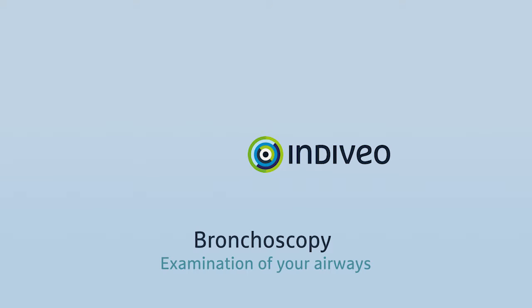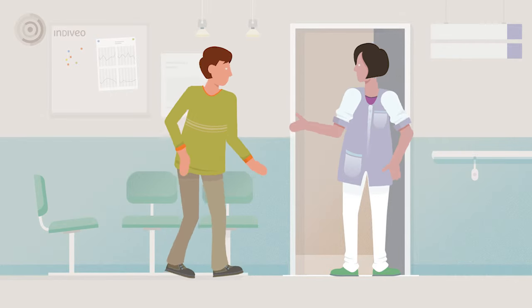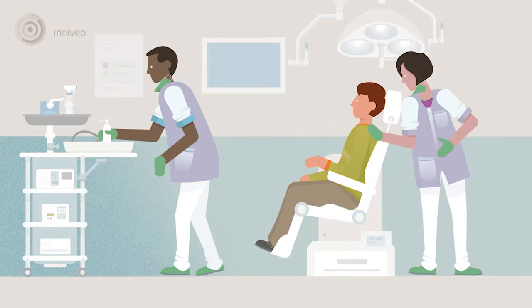Bronchoscopy examination of your airways. You will be called from the waiting room and take a seat in the examination room.